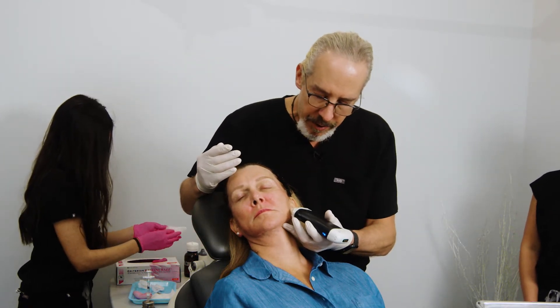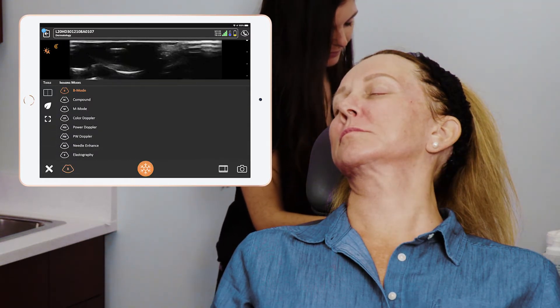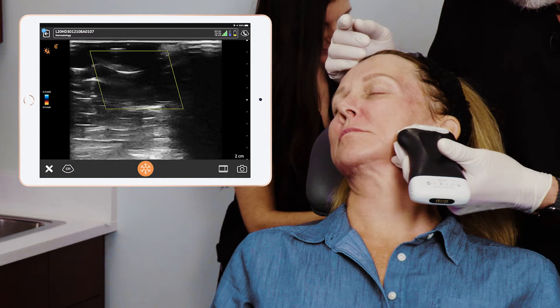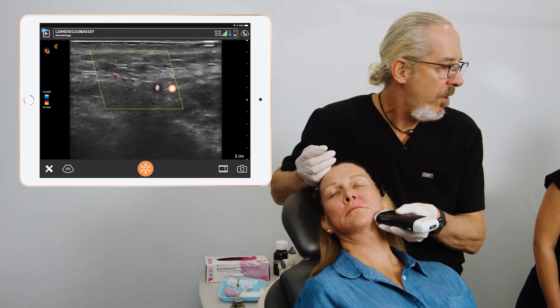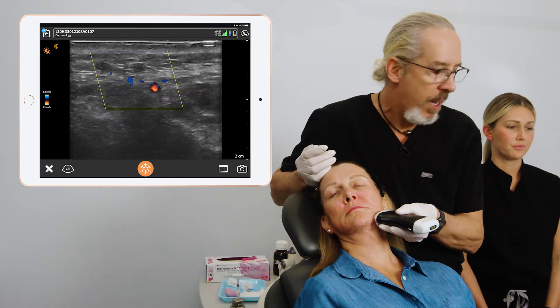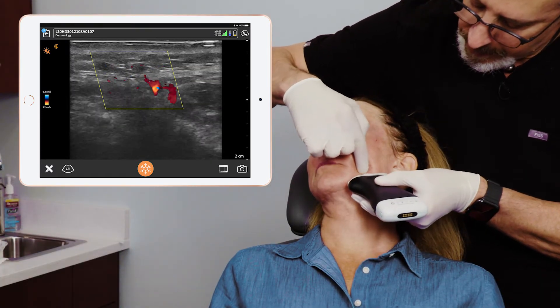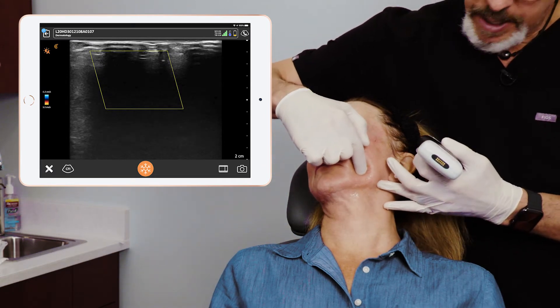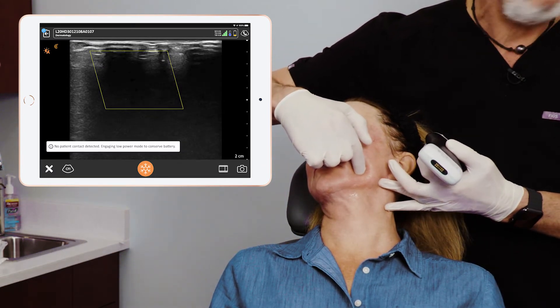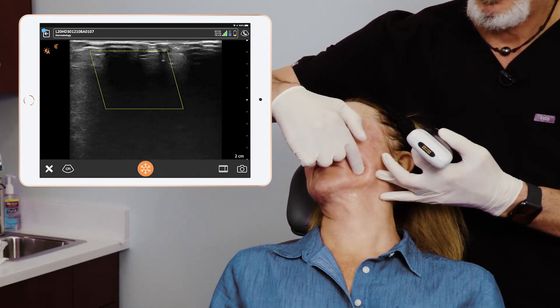Now let's look at the antagonial notch on this side. I'm going to go into color Doppler on this side and we can identify where the arteries are here. There's the facial artery - it's about midline, right here. So there's the facial artery, but we're injecting back here. So we have significant room for our injections. Facial artery here, injection point here.